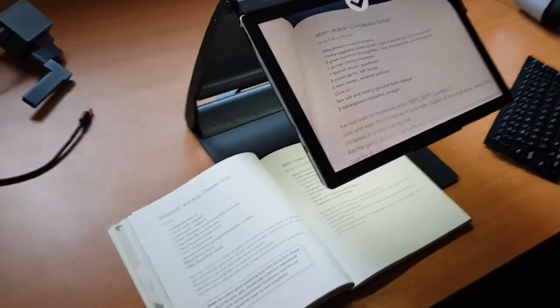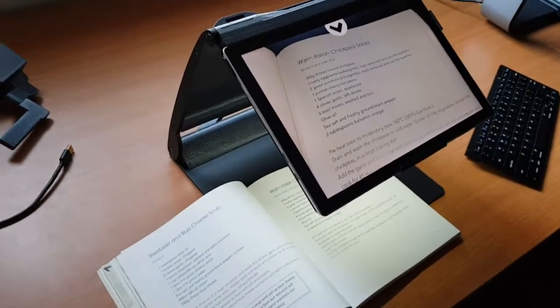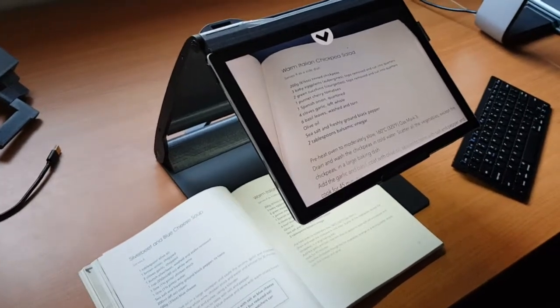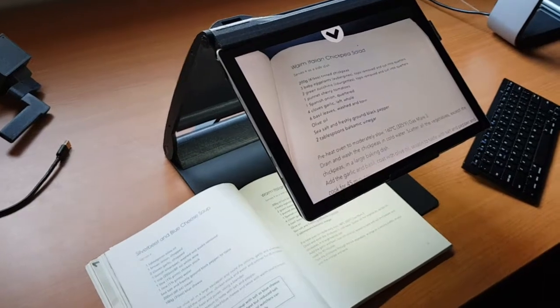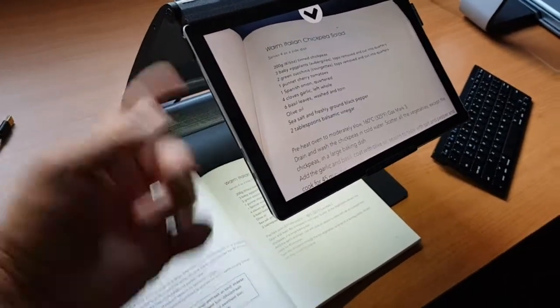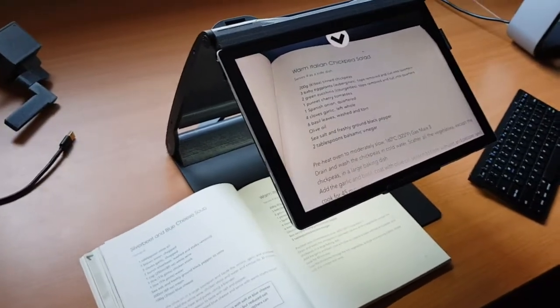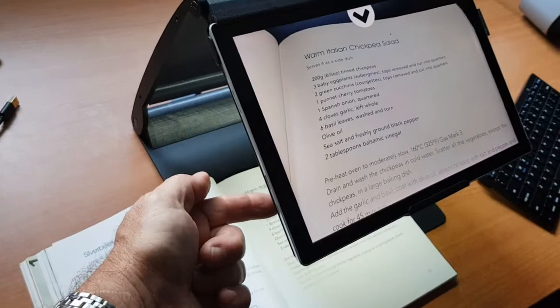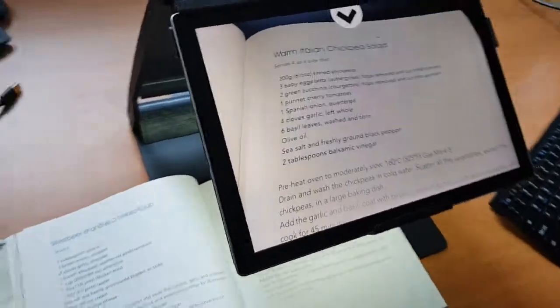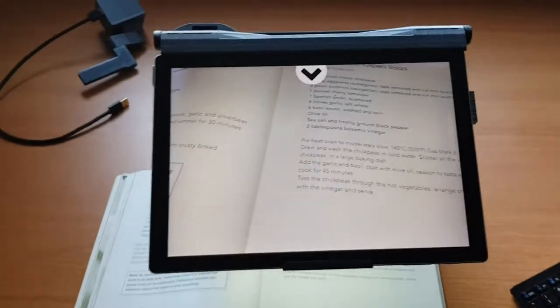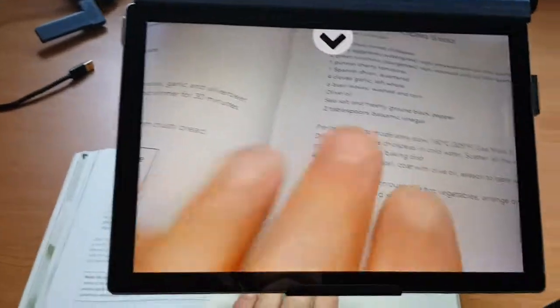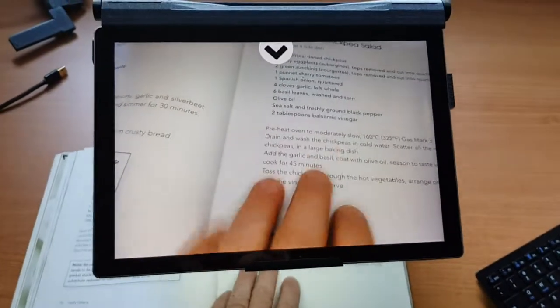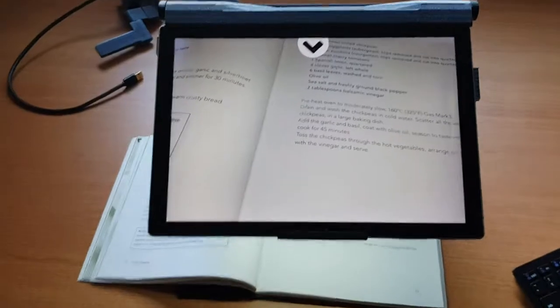Today I'm going to be showing you the Mercury 12 portable electronic magnifier, which comprises a Surface Pro Windows laptop tablet mounted in a frame. This is the frame here, which can fold up for transportation, and a lighting mechanism underneath the frame here. Running some special ReadDesk software, the Surface Pro's back camera can magnify paperwork and handwriting directly underneath the screen here.